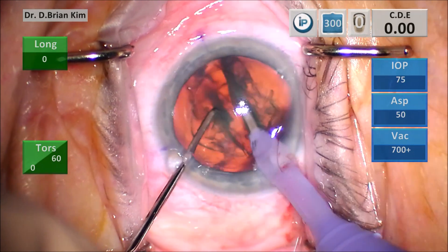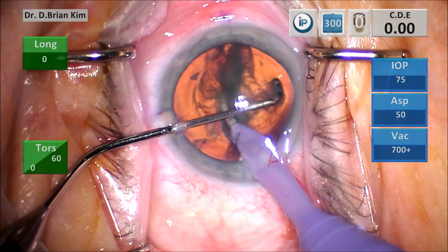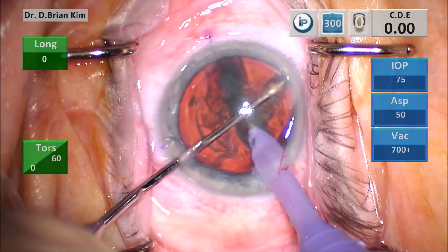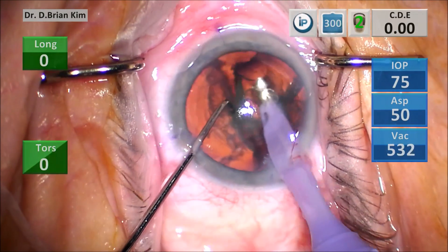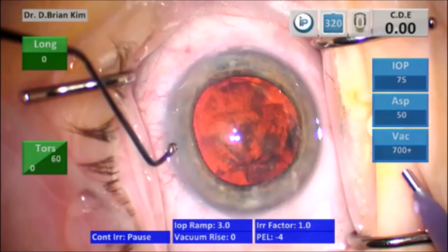I bring the two instruments together in the center and the chop is initiated without difficulty. The cross chop uses the same maneuver of pronating and supinating the wrist, then bringing the chopper into the middle and fracturing.